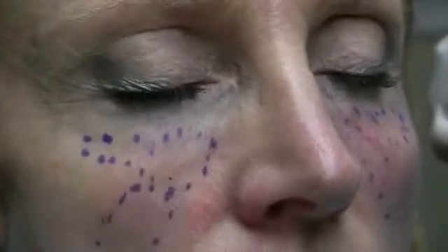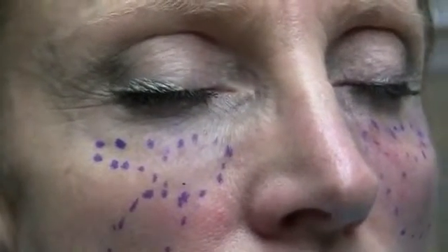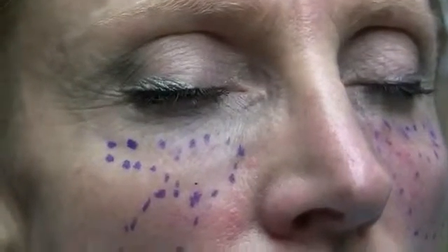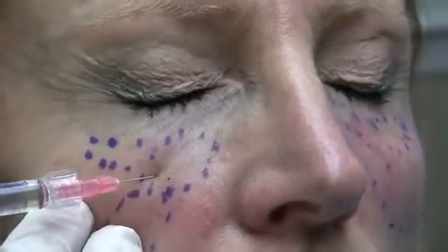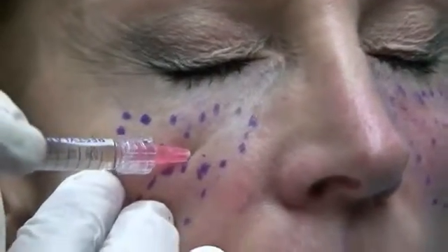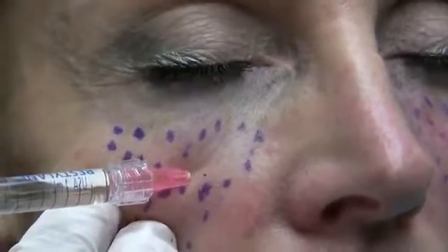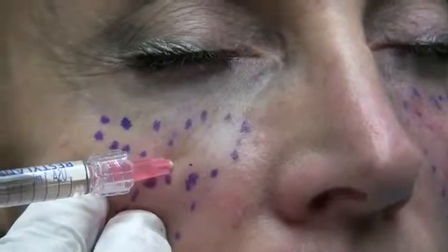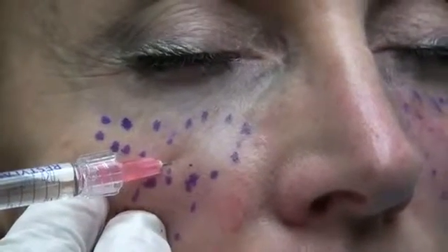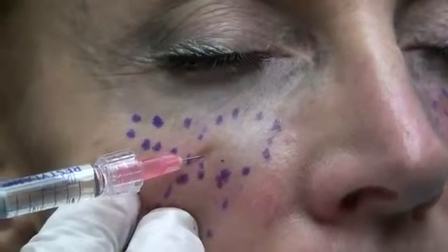And so we'll proceed on the other side. I want to be in the periosteal region, so I want to be deep for sure to the orbicularis oculi muscle. And so we're going to go back here, and we're going to slowly inject. And I'm using Restylane for this injection. You can see how nice it's plumping.